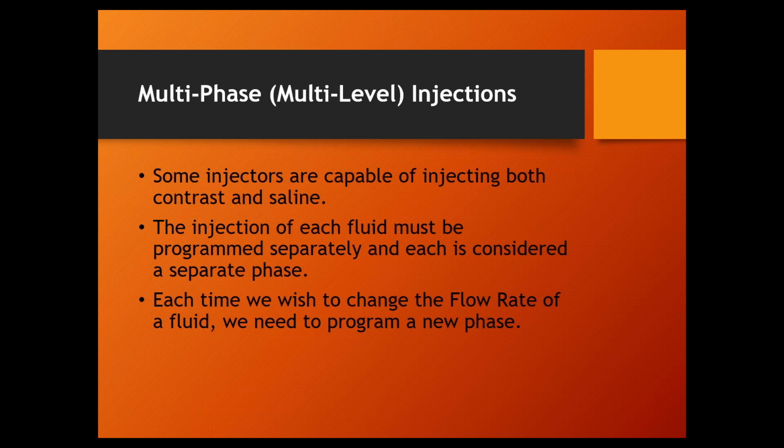Most contrast injectors, for the most part, can shoot anywhere from 4 to 8 different phases. 8 phases is a lot of phases. I don't think I've ever seen an actual protocol with that many phases, but that's what it is capable of.